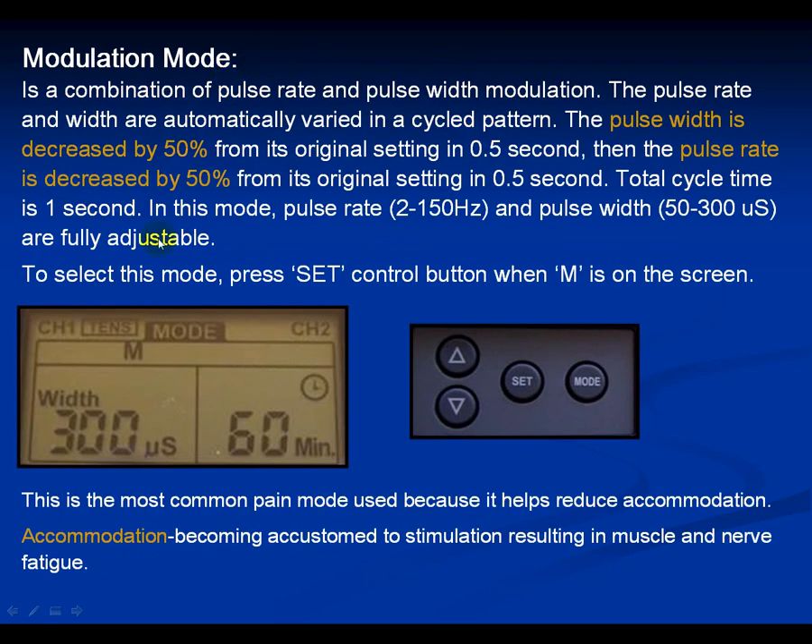Modulation mode — which we're training on right now — is a combination of pulse rate and pulse width modulation. The pulse rate and width are automatically varied in a cycle pattern. The pulse width decreases by 50% from its original setting in half a second, then the pulse rate decreases by 50% in 0.5 seconds — total cycle time is 1 second. You can adjust the rate from 2 to 150 and the pulse width from 50 to 300. This is one of the most common pain modes because it helps reduce accommodation where your body gets used to the same stimulation over time. Pause this slide and practice modulation.